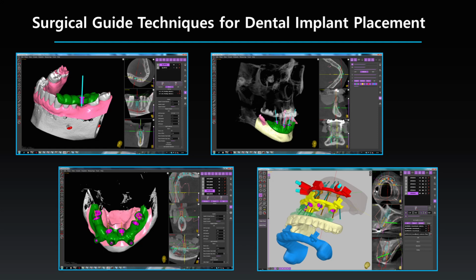Various designs are developed according to the type of guide support, including tooth-supported, mucosa-supported, and bone-supported surgical guides. The bone-supported surgical guides are commonly applied to patients who need more extensive bone surgery. Therefore, the reflected flap may make the correct intraoperative positioning of the guide more difficult. The tissue-supported surgical guides are mainly used for total edentulous patients, and the resilience and the thickness of the mucosa may affect the correct seating of the surgical guide.